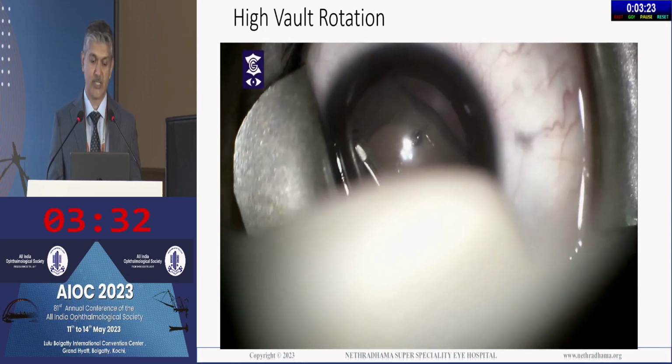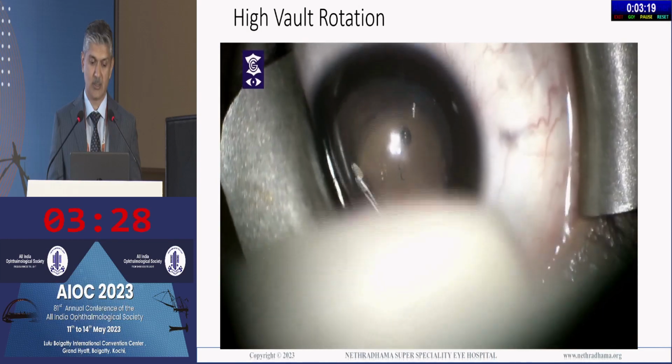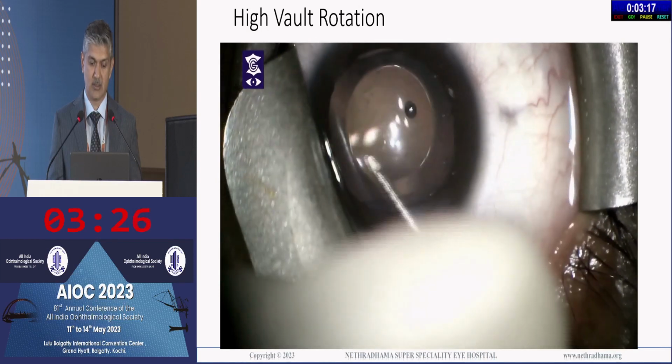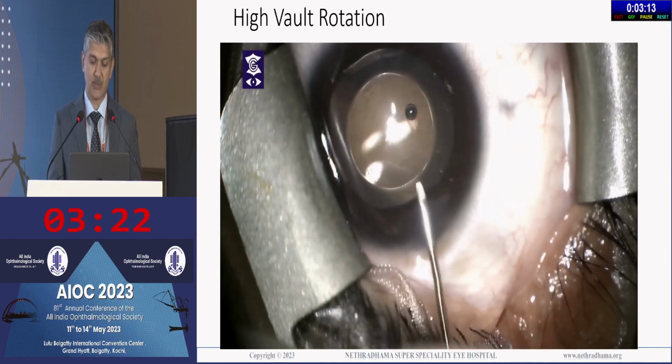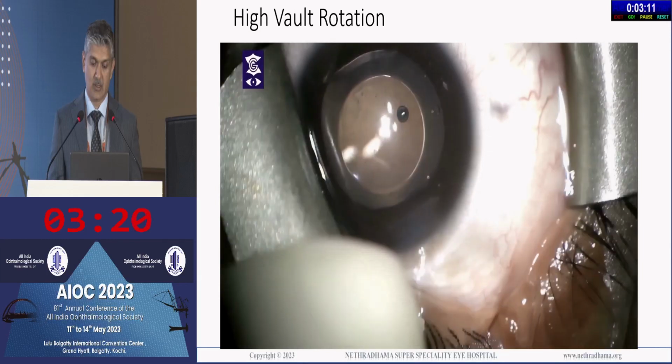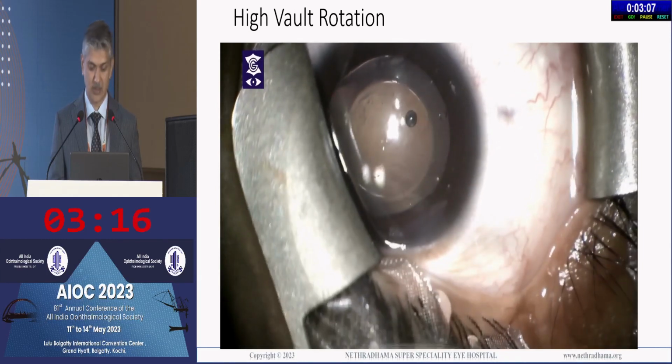So very gently you can rotate it. Rotate it and place it, and then you can remove the viscoelastic and close the eye.